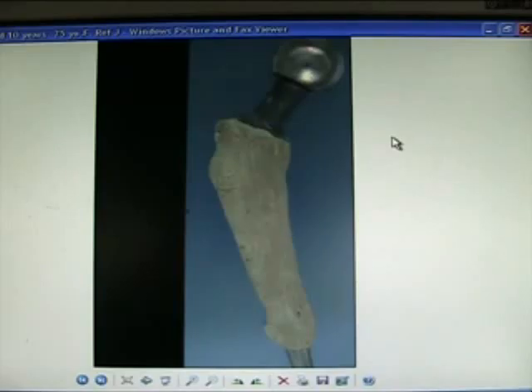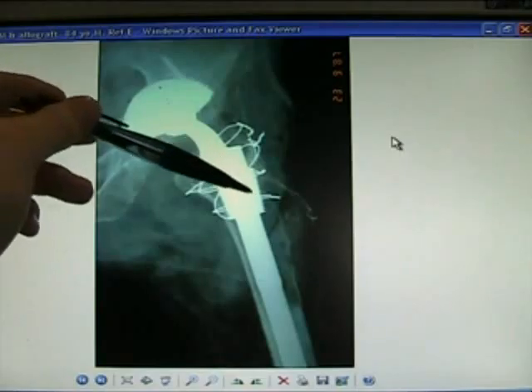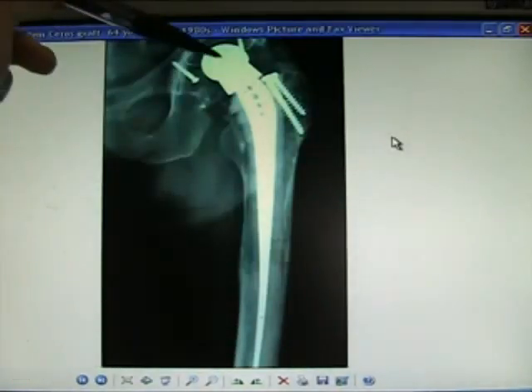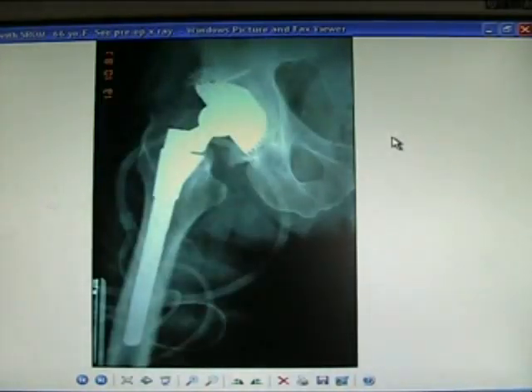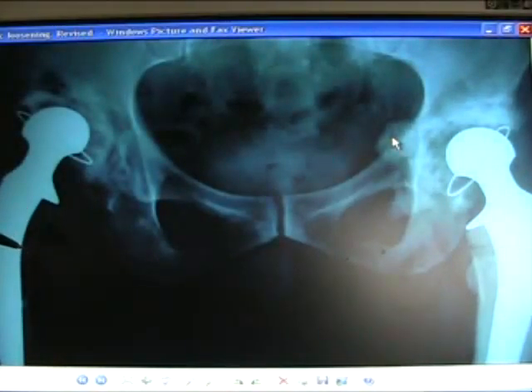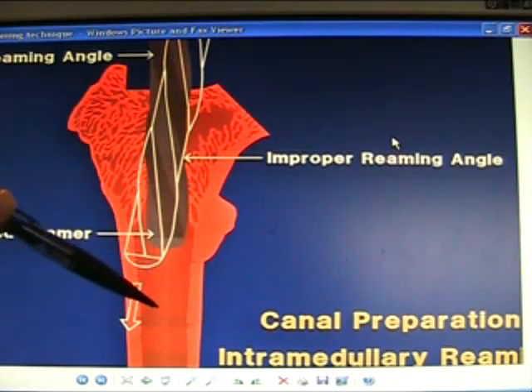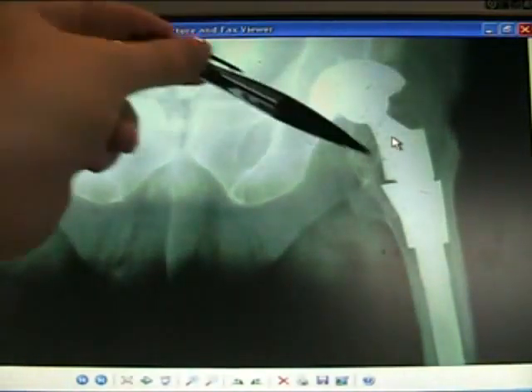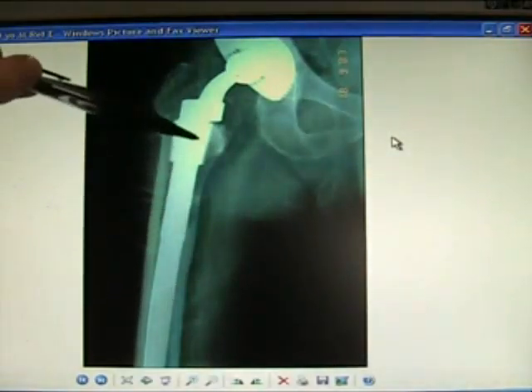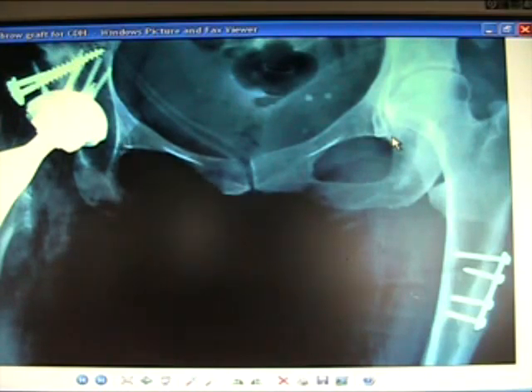Here's a hip replacement that's been retrieved. Look at the cement mantle — it's loose between the cement and the bone. Here's a revision situation — non-cemented, with a cement mantle. Using a Huckstep nail. Revision with the SROM system. This loosening is called aseptic loosening. Preparing the acetabulum and canal — there may be a lot of bone loss. You need bone grafting to deal with it. The SROM system was successfully used. Here's an eyebrow graft at the acetabulum — once you take the old cup out, there's a big hole, so you put bone grafting in and reconstruct it.